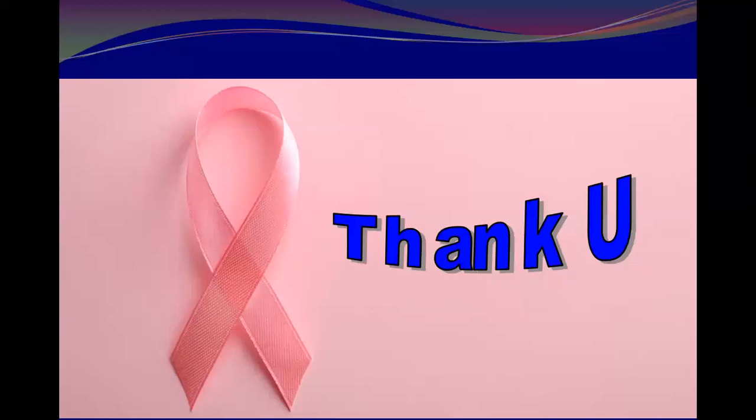Thank you. In the section of annotation, you said that we have 3 zones, zone 1, 2, and 3. The question is, is there any demarcation between these zones, or is it just suggestive? No, there is no demarcation. It just depends on whether it is a small or large breast. In front of you, you can just divide the breast roughly into 3 equal parts from the periphery toward the nipple, and even the nipple area is not included.